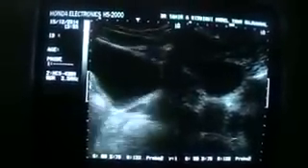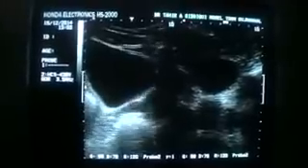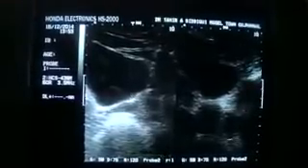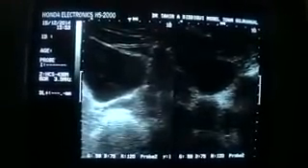I would like to have another good view for you. And this small tail-like structure is the terminal rectum in longitudinal section.